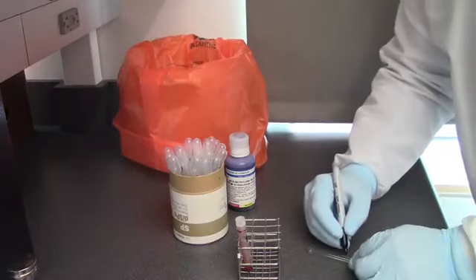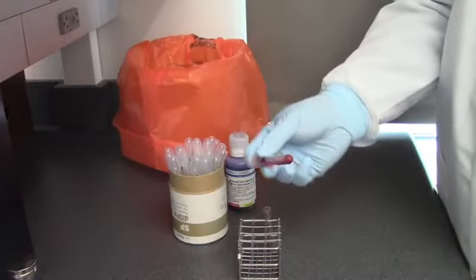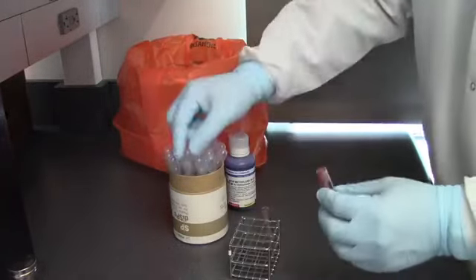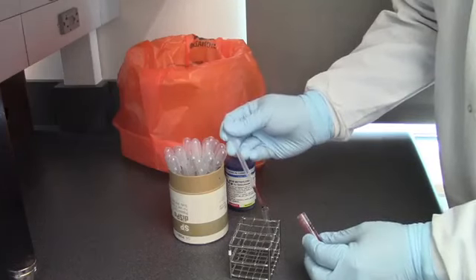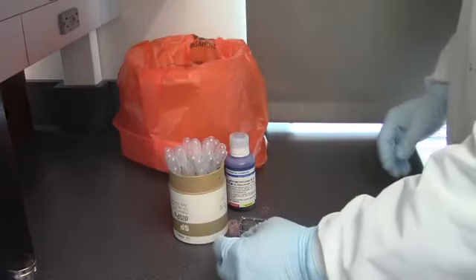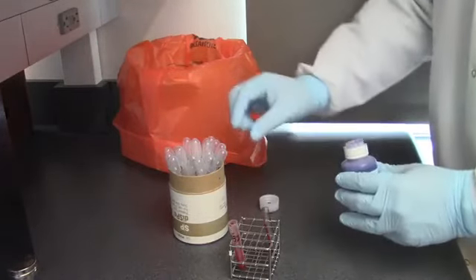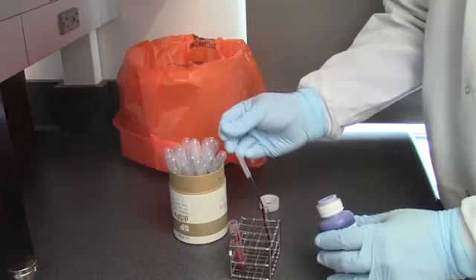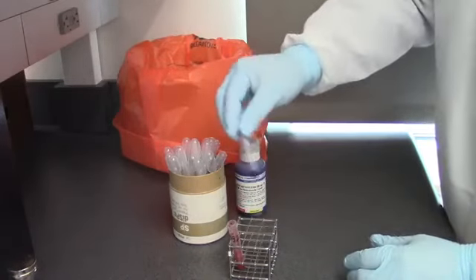To stain the reticulocytes, label a 12 by 75 tube with the patient information. Mix the sample. Using a disposable pipette, add 3 drops of sample to the appropriately labeled tube. Using a different disposable pipette, add equal amounts of new methylene blue stain to the sample, and swirl the sample to mix.